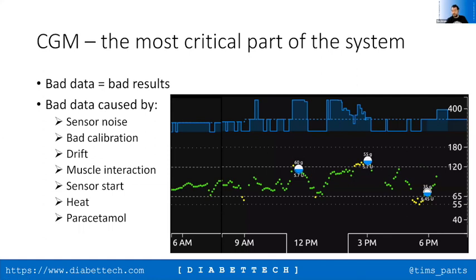And that's obviously an issue if you're using an APS system, especially if you're using one which is doing some form of super microbolus, where it sees a sudden jump and potentially it then SMBs. Now, built into Android APS, and I don't know if the same thing is built into Loop and into OpenAPS, the code doesn't allow it to give an SMB if you get greater noise data than a certain threshold, or if the increases in glucose levels are greater than a certain threshold. So it does do some work to alleviate that risk.